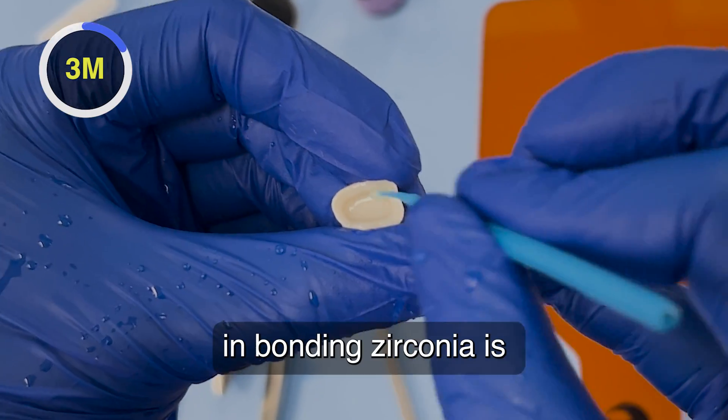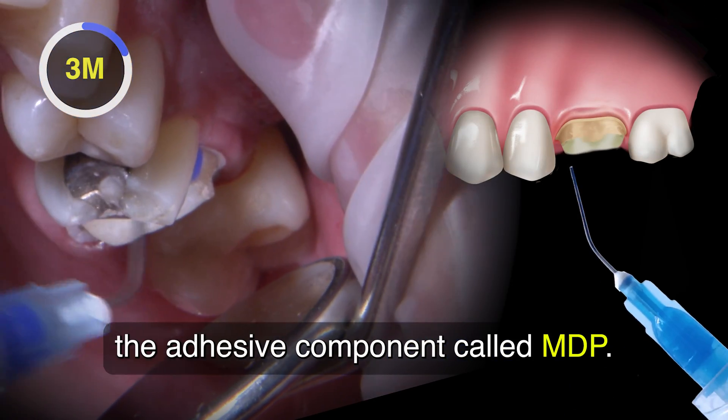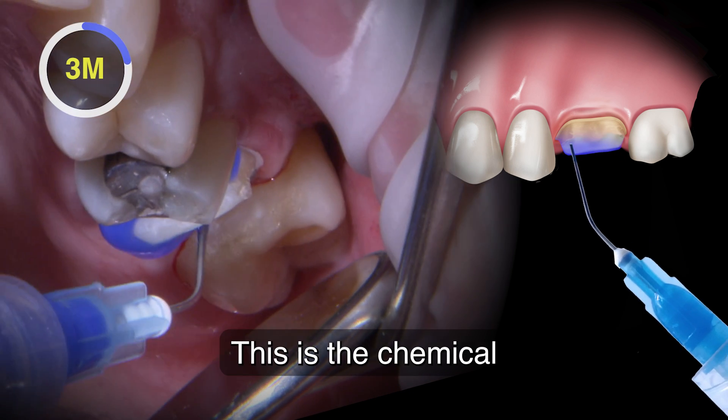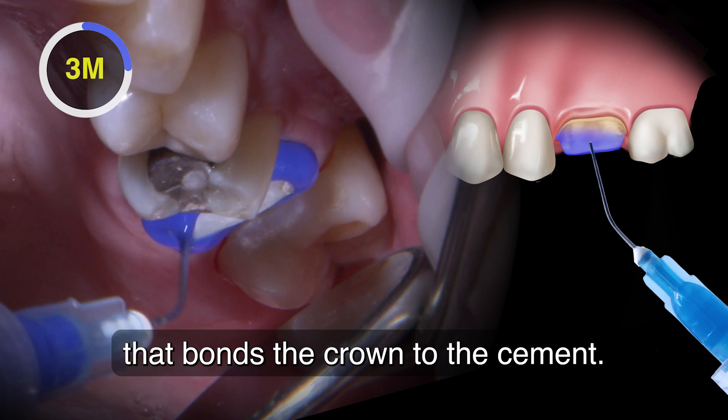The critical ingredient in bonding zirconia is the adhesive component called MDP — the chemical coupling agent that bonds the crown to the cement.